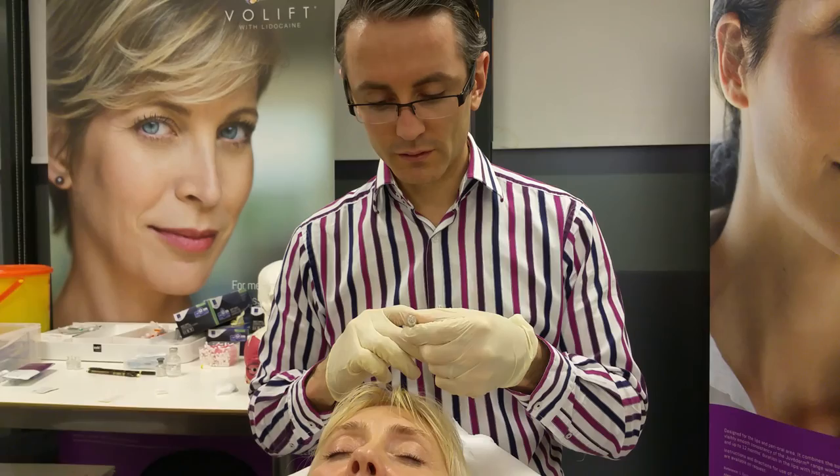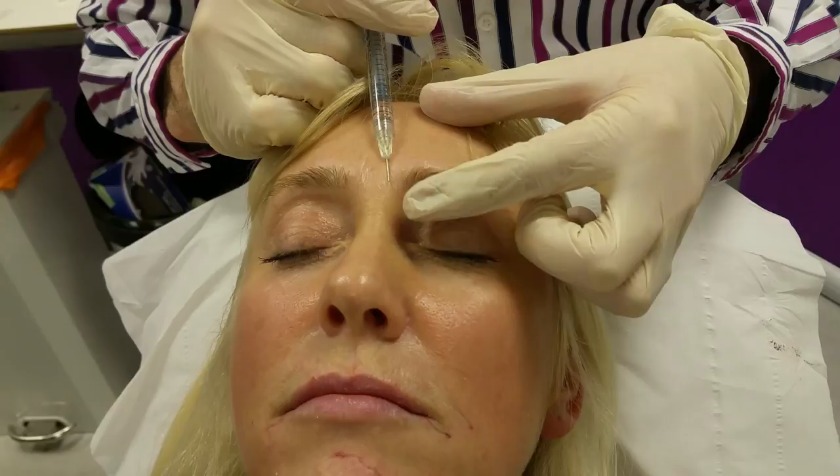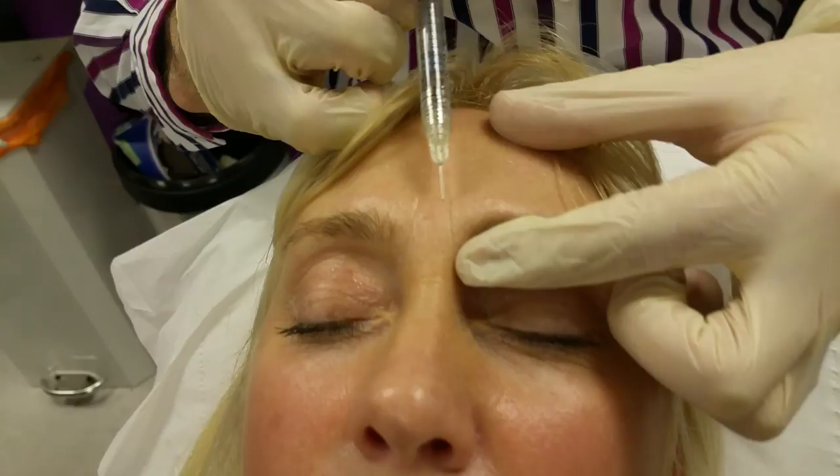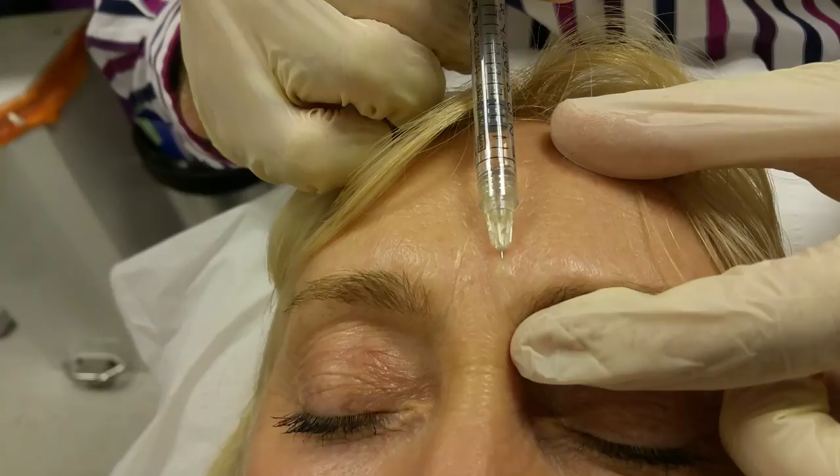So let's have a go. We line up as with all our injections, decide where you want the filler to go, and rest the needle on top of that. I can actually feel the artery here — I can feel a pulse. I'm going to slide in nice and superficially but not too superficial. A little tenting, so the skin is bulging slightly, lets me know that I'm not going unnecessarily deep. That's the most important safety thing — the depth.